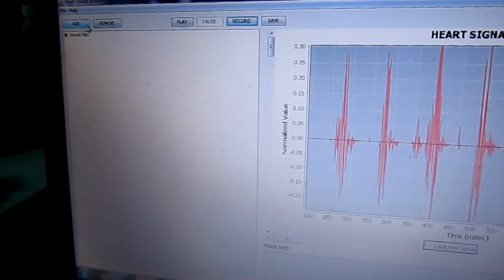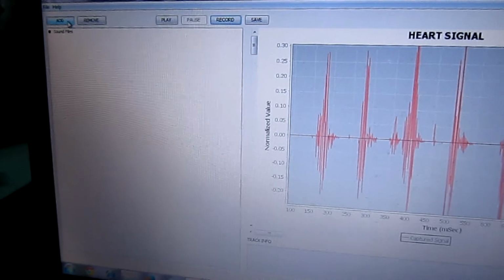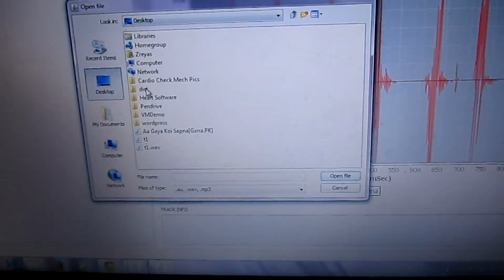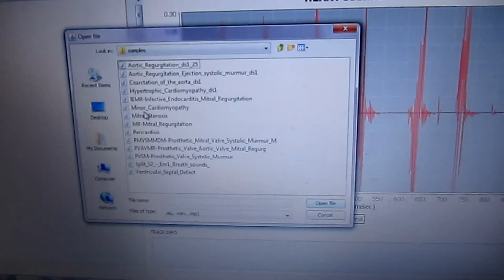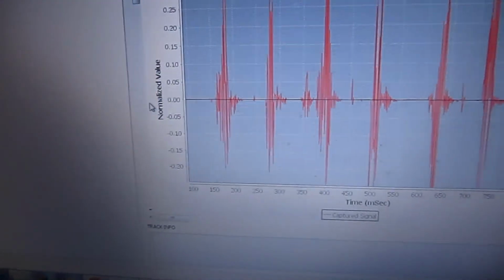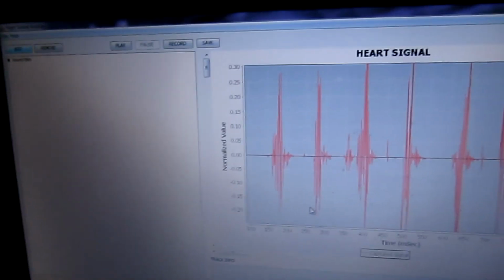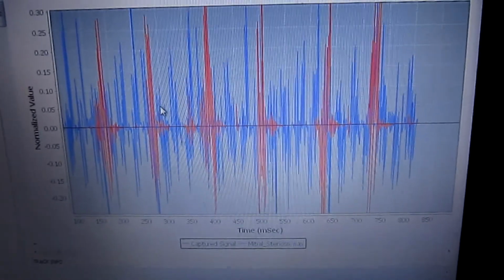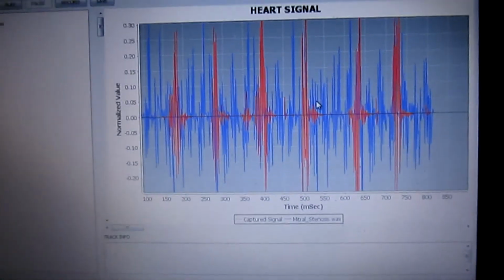And we can also compare it with some pre-recorded heart sounds of heart diseases here within the software. We can just go and add from a list of samples. For example, this is mitral stenosis. See, the blue one is a pre-recorded sound, and the red one is the one we recorded live.